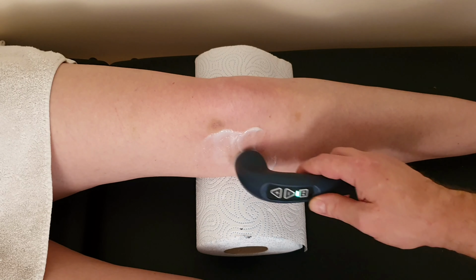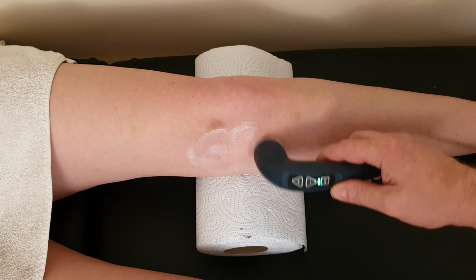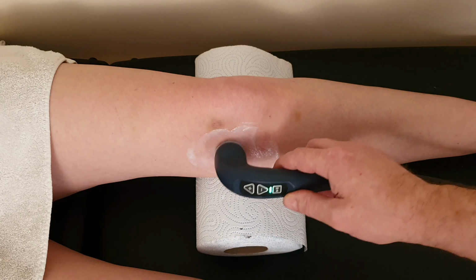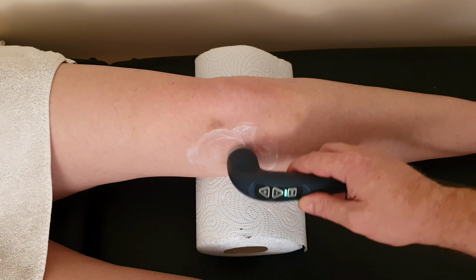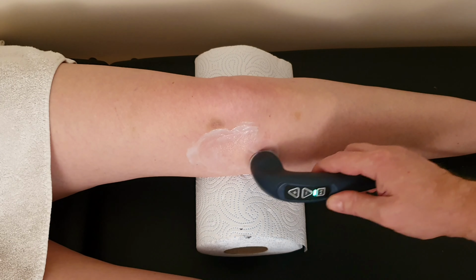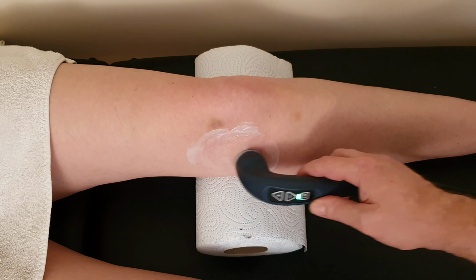You may find yourself needing to turn the treatment down from level 10. You can just use the down arrow on the treatment head here. You'll see I haven't got my thumb over the down arrow. It is good practice to keep your thumb over the down arrow just in case you need to turn it down, or over the start stop button, so the start pause button basically. The reason for that is you can use either to turn the machine down.